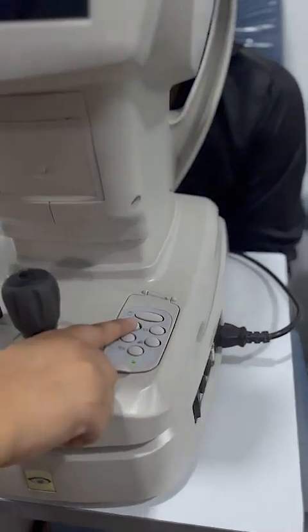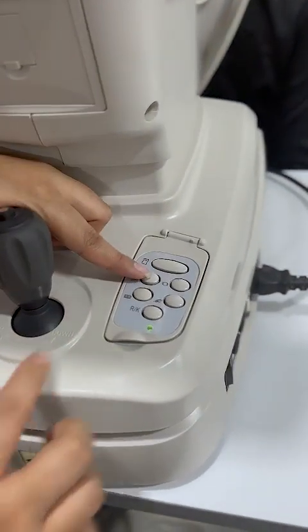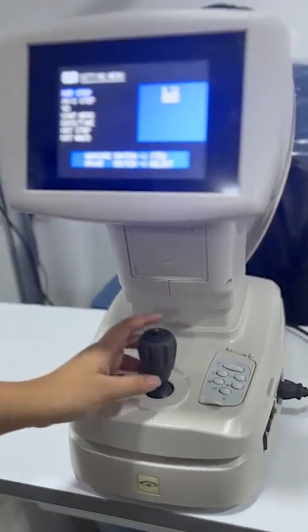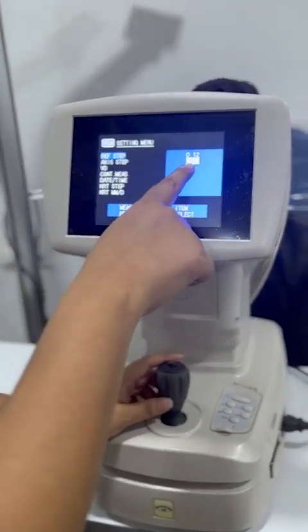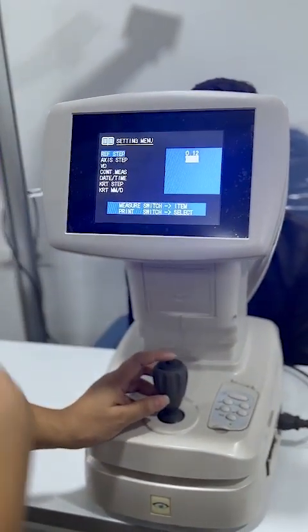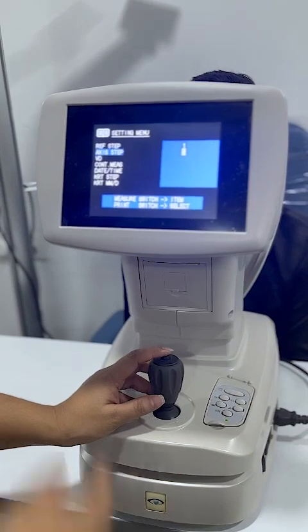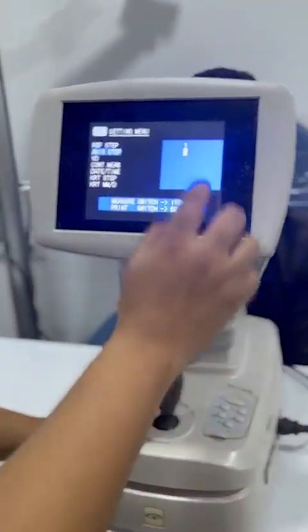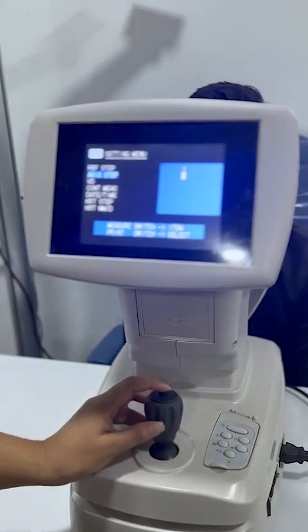This button is for the settings, and this is the settings menu. The refracting step should be 0.25 — use the main cursor to go down. The axis step should be 5 degrees; if it is 1 degree, then you can adjust these settings.